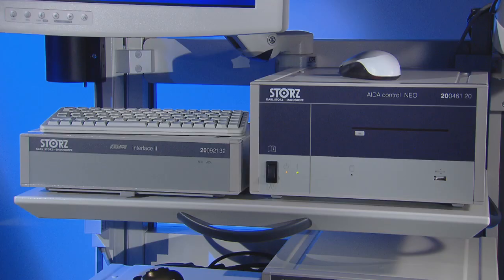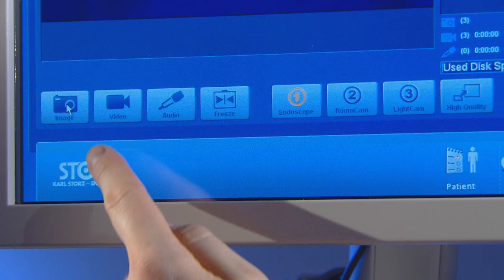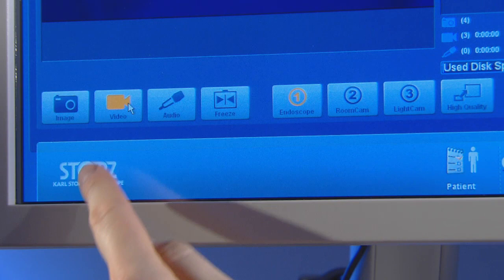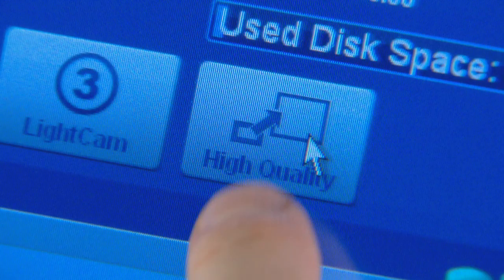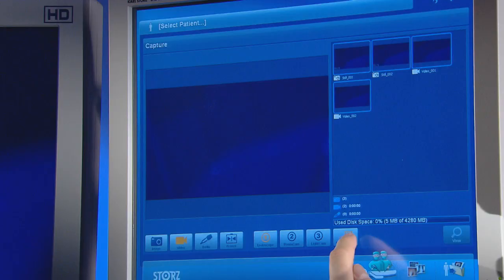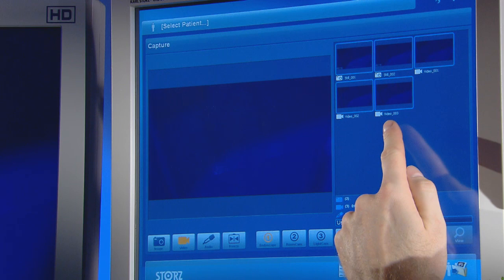The new AIDA control NEO documentation system offers a unique and intuitive workflow-orientated user interface based on well-known maintenance advantages and benefits. Increased image quality, resolution, and full high-definition and standard-definition recording provide the possibility to operate the system in the sterile field, giving the surgeon and OR team independent, efficient, and ergonomic control of the capture device.